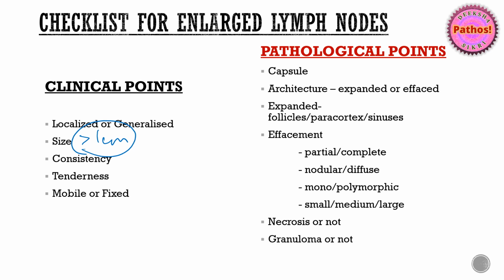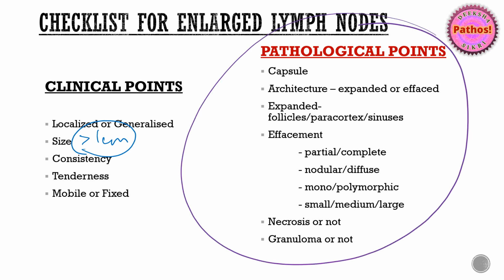So this list over here is extremely important for every pathology resident to bear in mind when you start looking at lymph node biopsies. Now, this is to tell you what the different reactive patterns are. You can see the black cells, the tumor cells, metastatic cells entering through the subcapsular sinus going into the sinusoid. So they'll expand the macrophage population.